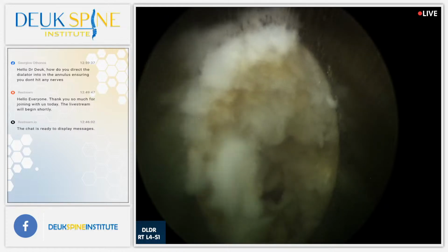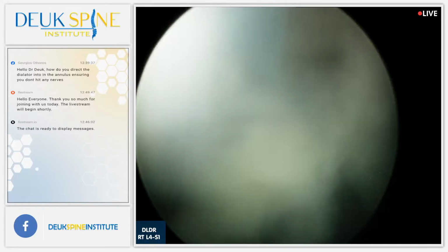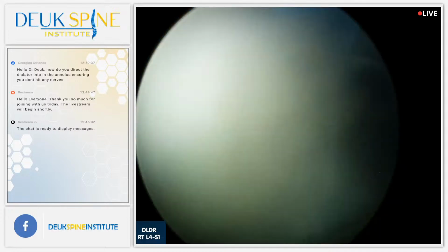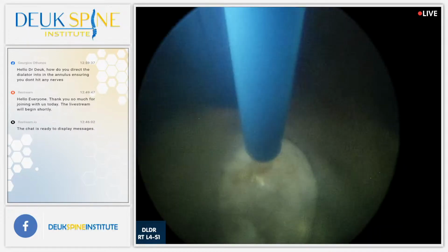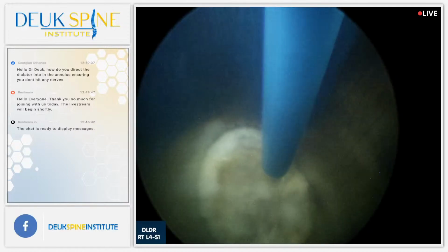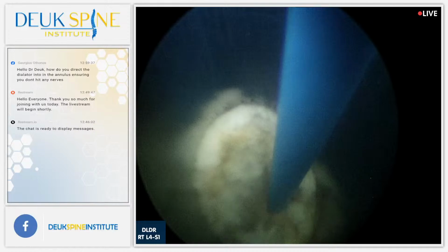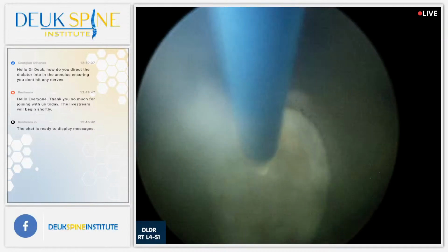And I use my X-ray machine to look at the anatomy. So just as a sailor would look at the land, the island, they would look at trees, mountains, rocks, beaches, contours, shapes, right?